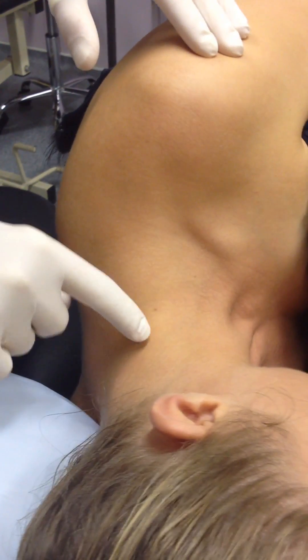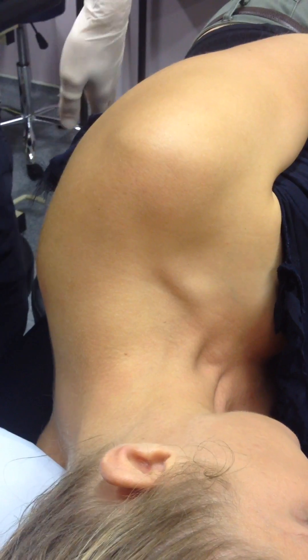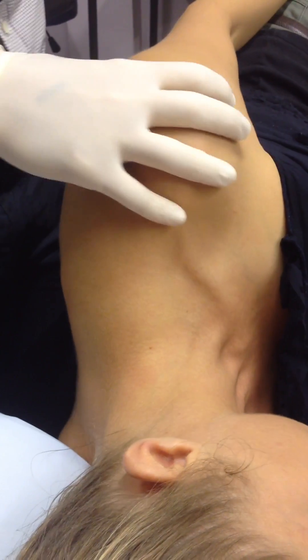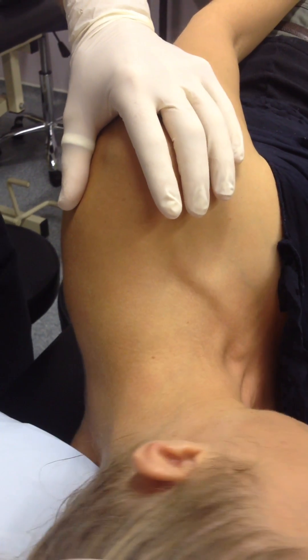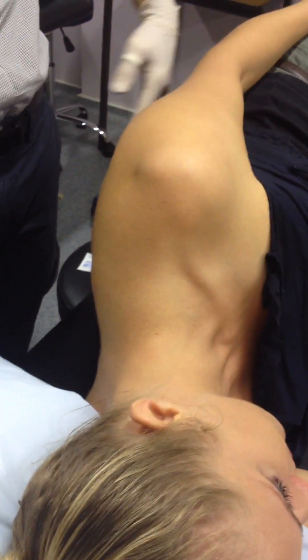Alright, so set up with left scap superior trigger point, really important. Knees bent a bit, which just straightens the pelvis and then it makes it easy to keep the torso straight as well. Arm up by the side and then you want the head nice and neutral and you don't really want them rotated as well. So pretty much a straight line running down.